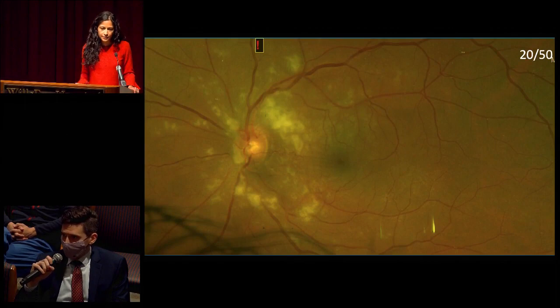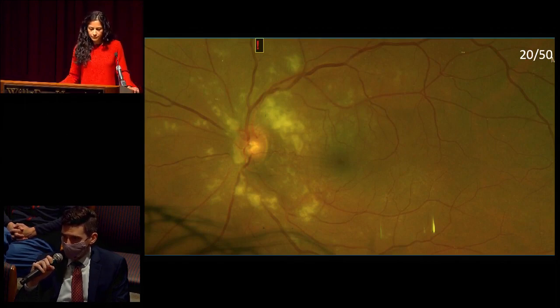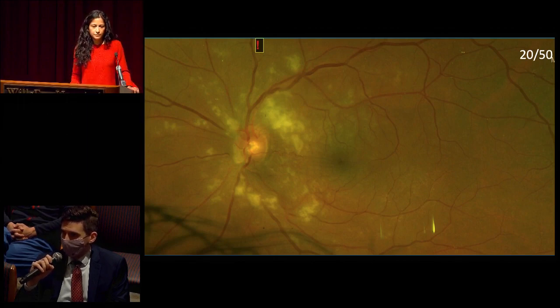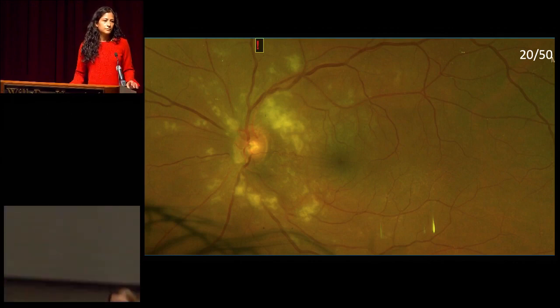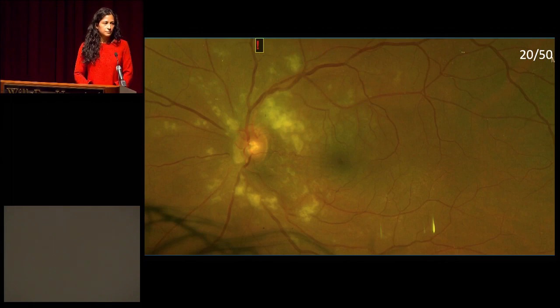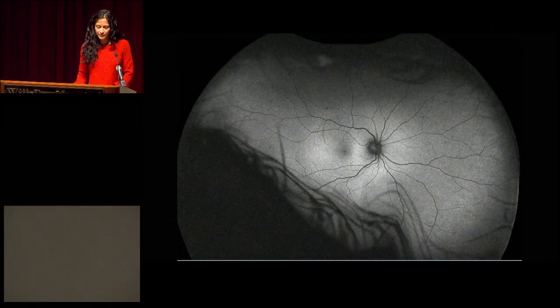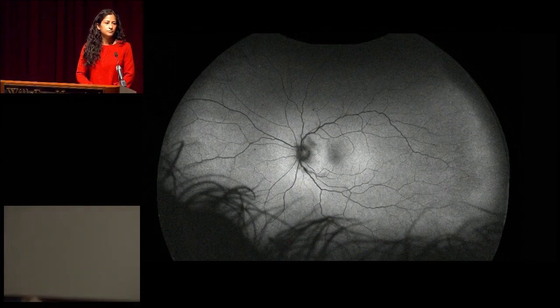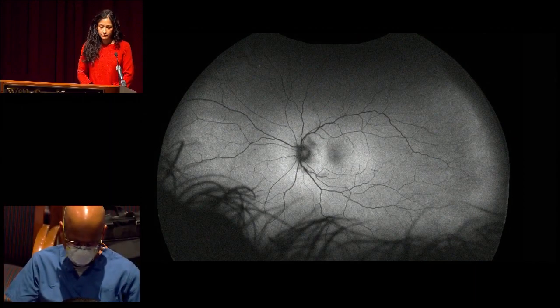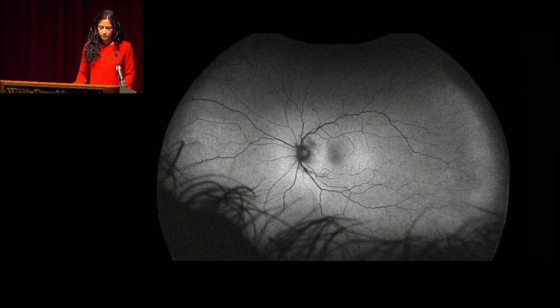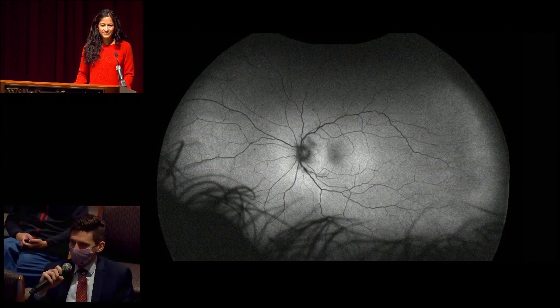A more zoomed image shows these areas better — possibly retinal whitening as opposed to the more superficial cotton wool spots in the peripapillary area, and subtle macular striae. The term peripapillary is correct; you could also use juxtapapillary, but in this case the term circumpapillary may be more descriptive since the spots completely surround the disc. Wide-field fundus autofluorescence shows a relatively normal pattern overall, but there is hypoautofluorescence in peripapillary areas corresponding to the cotton wool spot changes seen on pseudocolor imaging.